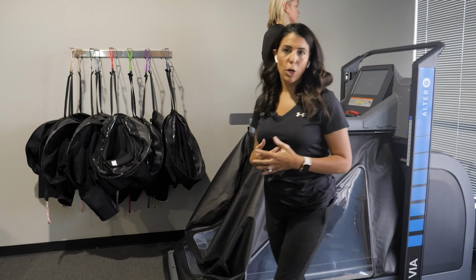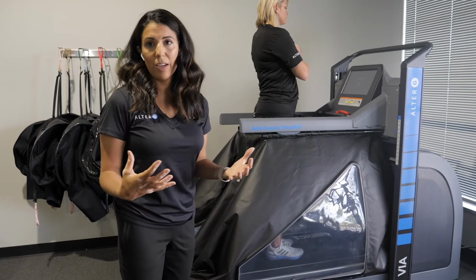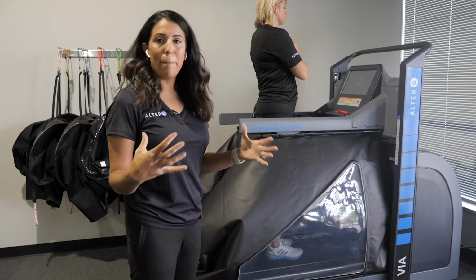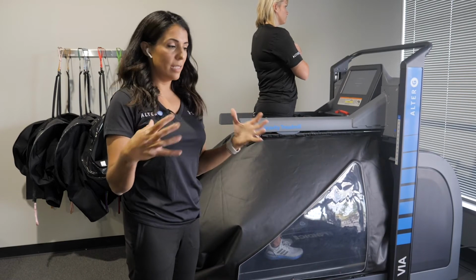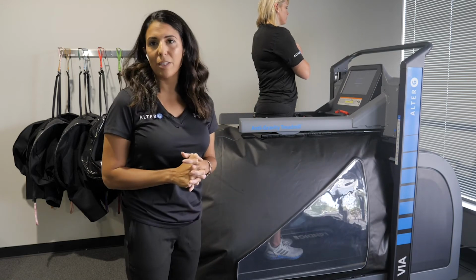And you'll see the bag start to fill with air. So what it's going to do, it's going to inflate with air, basically to the max capacity that it's able to unweight this specific user, and then it'll bring it back to 100%.